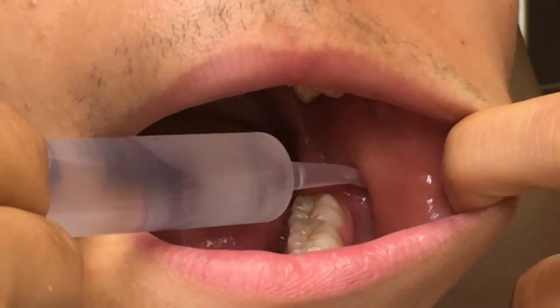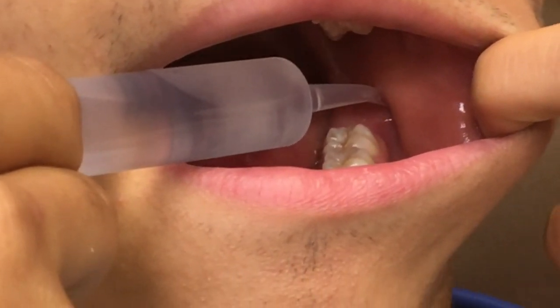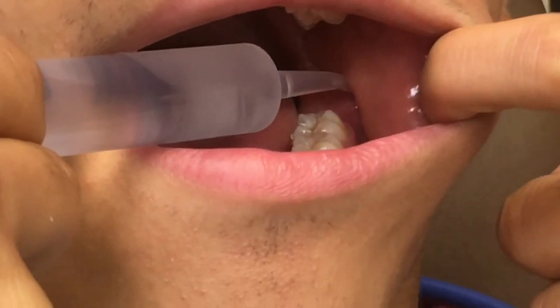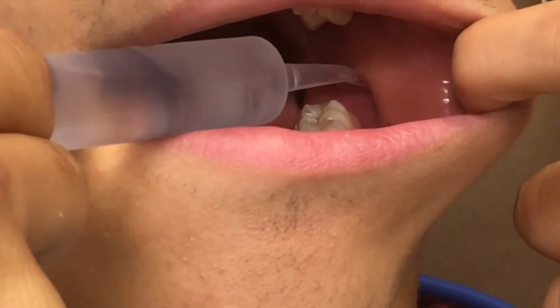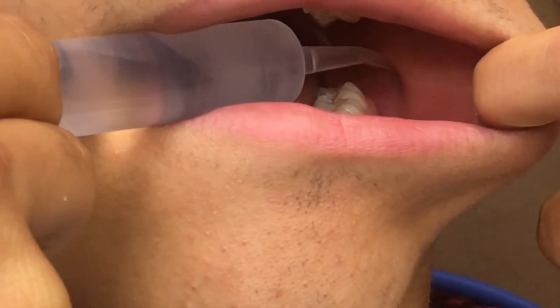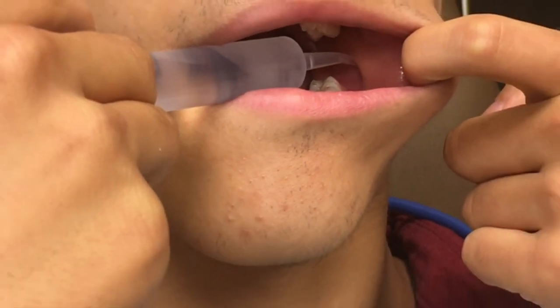If you take the tip and put it very close to the opening — not quite in the opening — because if you put it in the opening it won't close; it'll take a long time to close. You're going to want to keep it about a quarter to an eighth of an inch away from the opening, and then just flush water in there until you start to see debris come out of there.